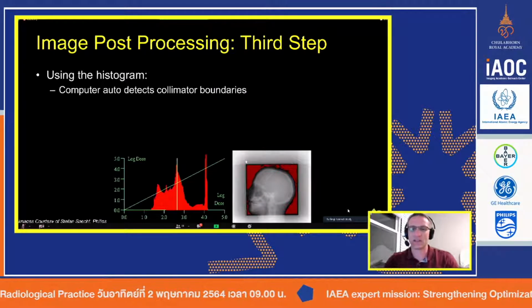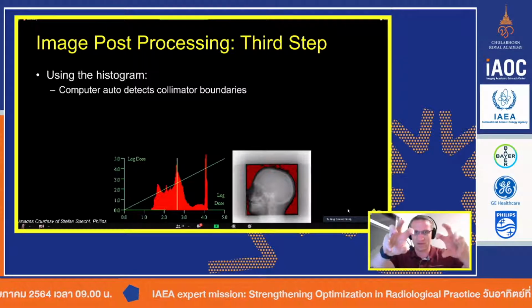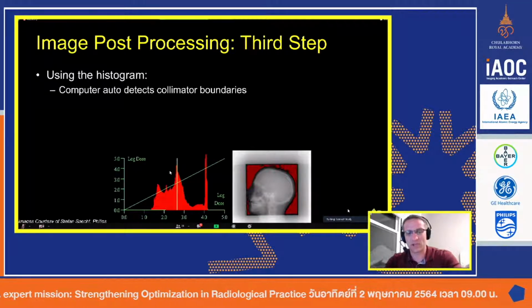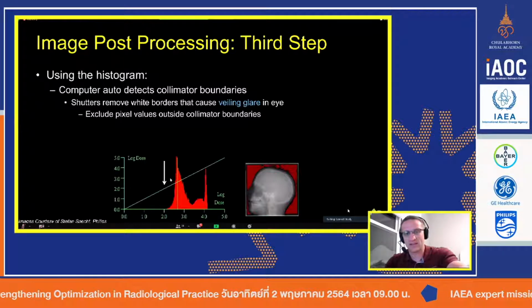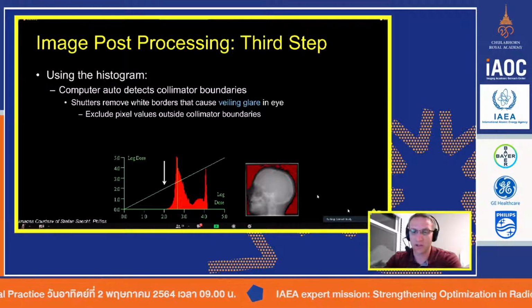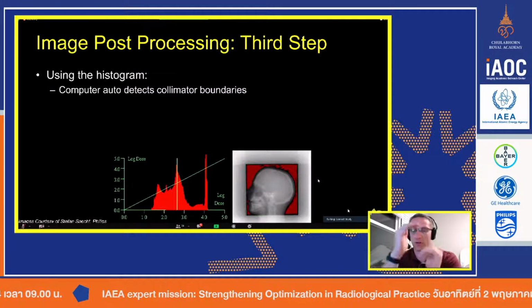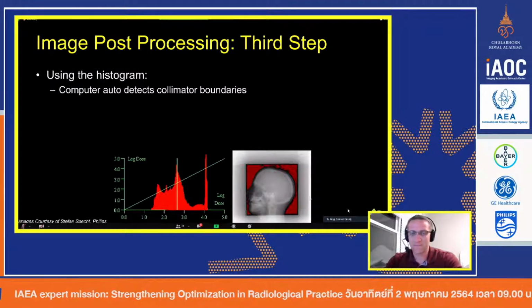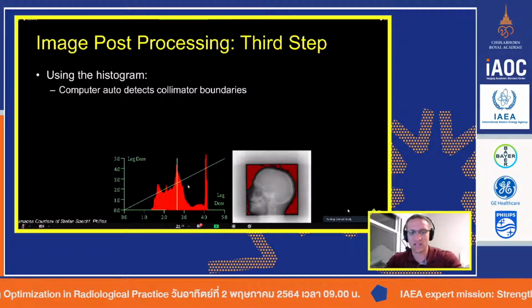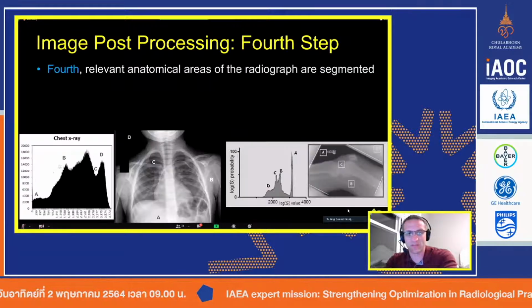The reason is that if you have good physical collimation, where you've actually dialed in the physical collimator so the light field and the collimations are all set, then when the image comes across, the system knows those pixels can go away. When you acquire a raw image, this part was directly exposed, and everything behind the collimator blades will look white like this. The system goes, oh, I know those are the collimator blades, so it immediately deletes all of these pixel values. That is what allows the system to do all of this processing right here.